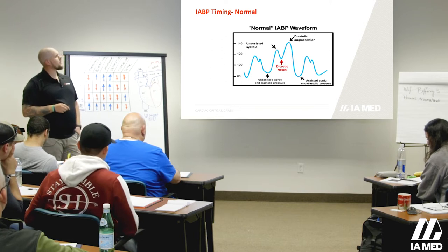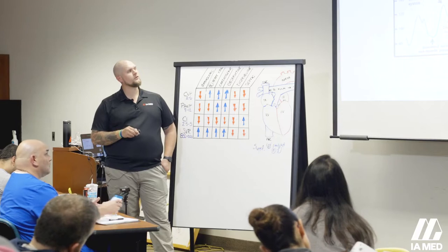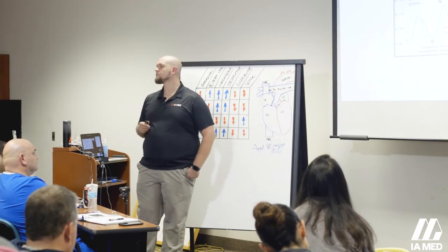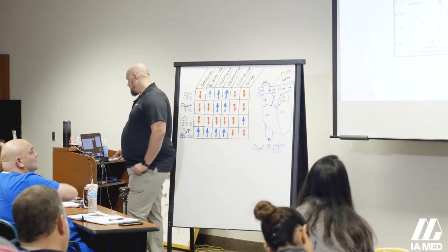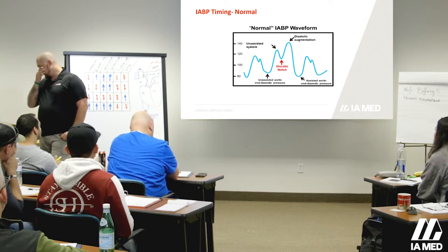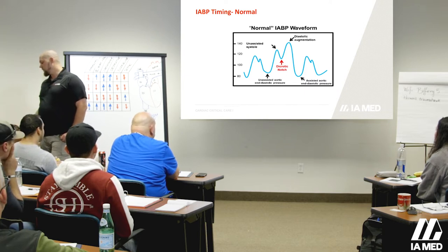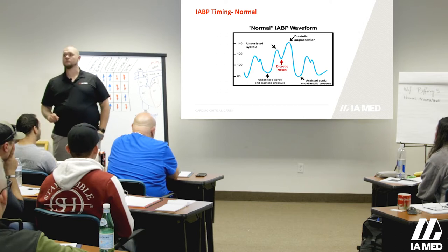A couple rules I want you to follow. If I were to cut off the page right here, what does this look like — something we covered earlier? An A-line. Exactly right. This complex looks just like something from an A-line, and that's exactly what it is. This is a 1:2 waveform, meaning every other beat is augmented or assisted. This is called the dicrotic notch, and it represents aortic valve closure.